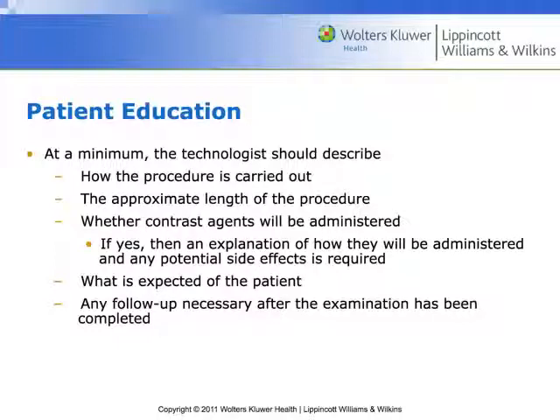Let them know if they need a CD. And I found most patients do not know whether or not they need a CD, right? If you're dealing with a cancer patient, they need a CD. Go ahead and make them a CD. If you're dealing with a teenager who hit his head when he was playing hockey, he probably doesn't need a CD, right?